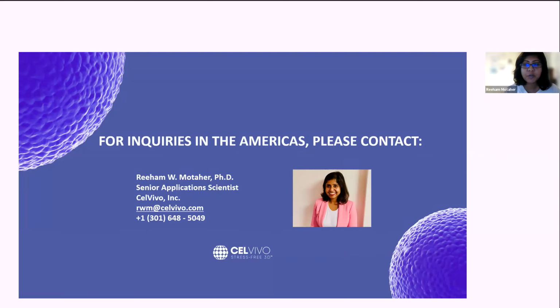And another question from a familiar face: when changing the media, is it okay only to change out 5 mils rather than trying to change out as much as possible without losing the growing organoids? I need an answer based on your current experience. Of course it's all right to exchange 5 milliliters instead of 10.